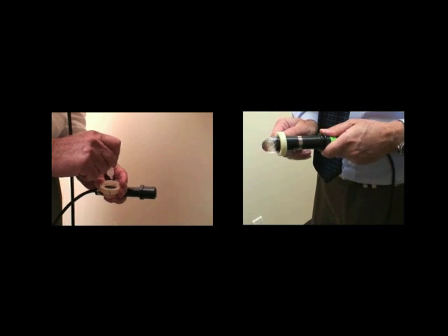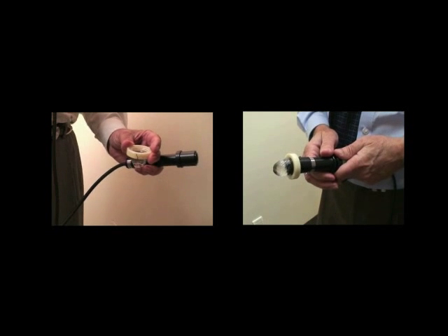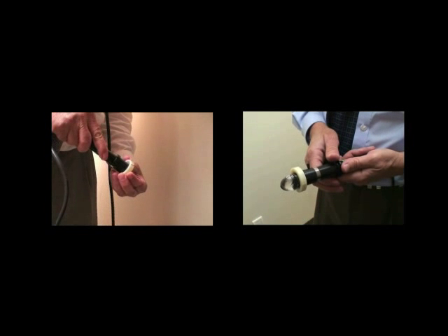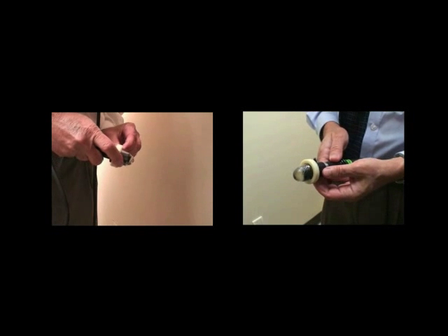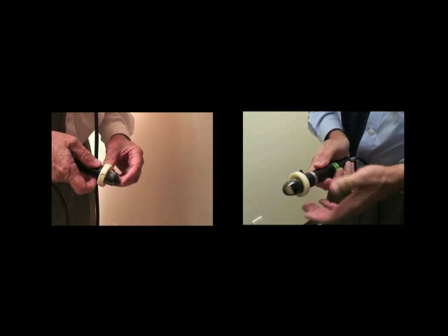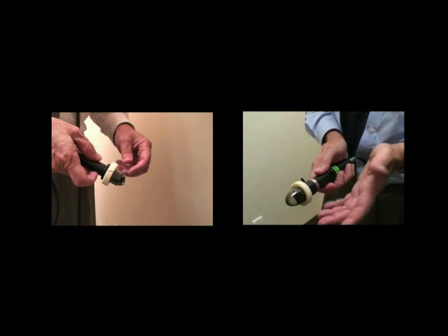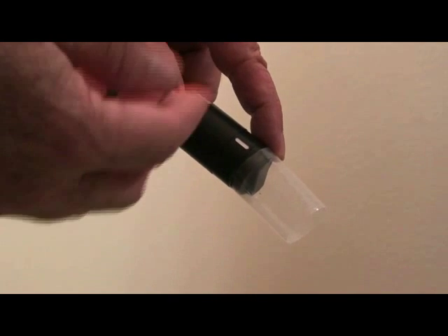Quantel Medical offers two types of UBM probes. There's the sealed 25 MHz unit, which is filled with oil, in contrast to the 50 MHz probe that must be filled with distilled water prior to use. Each of these units requires a different fill method when using a ClearScan cover. Peer-reviewed literature shows that the sterile or sanitized ClearScan cover, which is pressurized to be safer than the open shell, prevents accidental probe contact with the cornea and is more comfortable. Further, the ClearScan is an FDA-approved device.